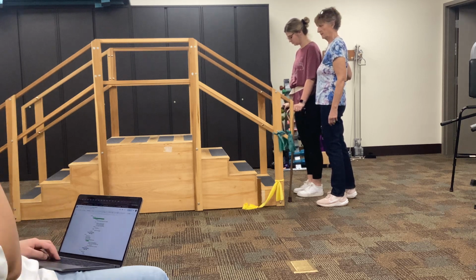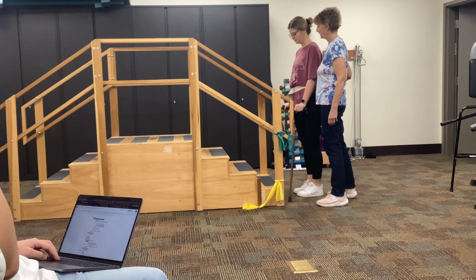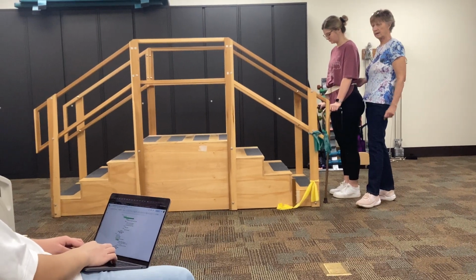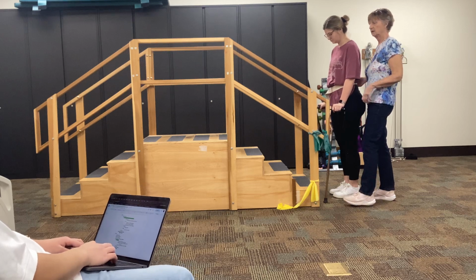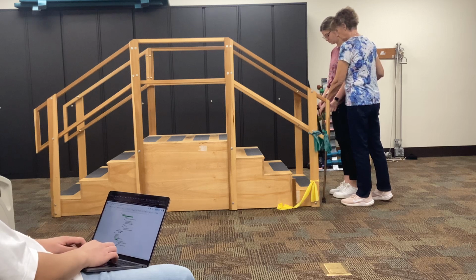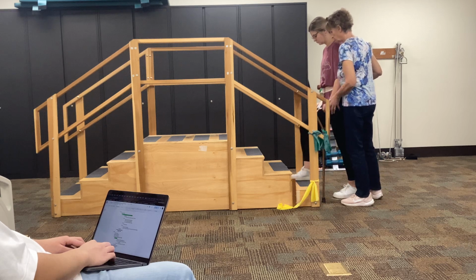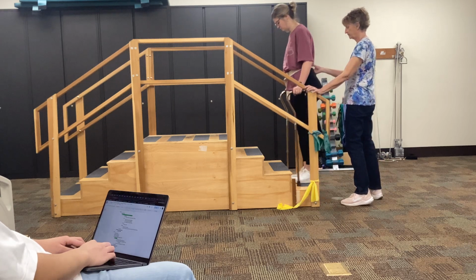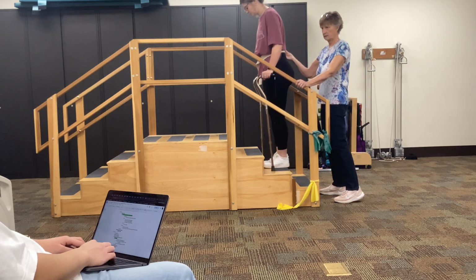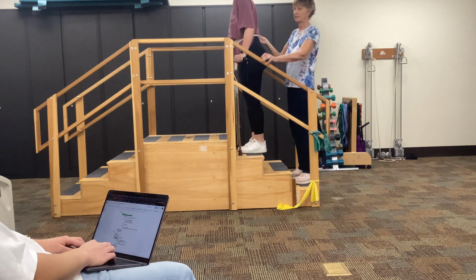Which side will they stay with? The right side? Good side or the bad side? Good side. Wrong. Bad side. Up with the good, down with the bad, and the assistive device stays with the bad side to support it. Okay. So going back to our 3-point is up with the good, so pushes off. No, crutches stay there. She pushes up, steps up with the right, little push, and cane's on the left. Okay. Go ahead up with the right. Cane's. Right. And cane's.